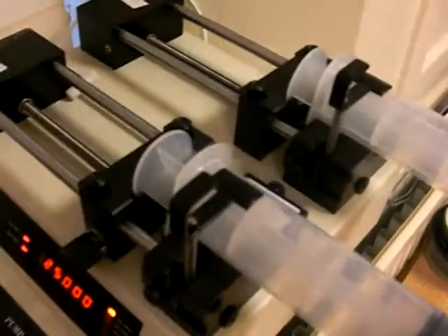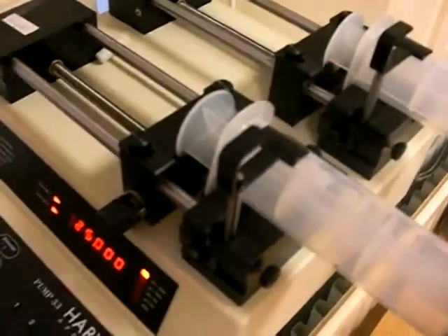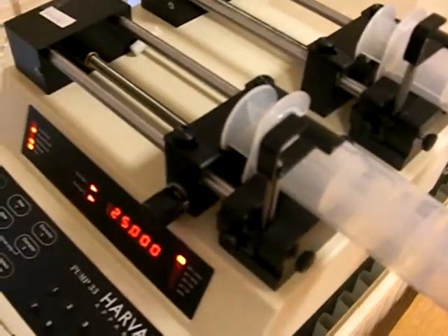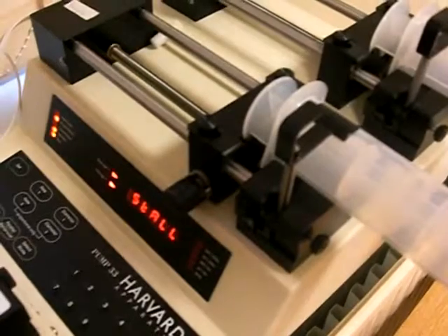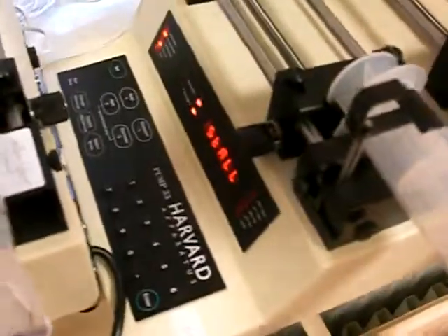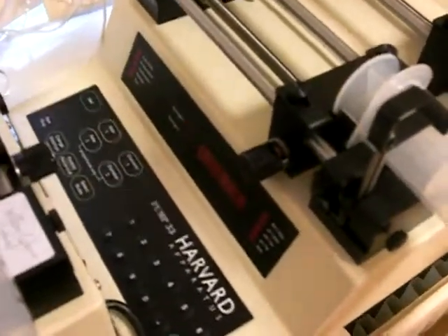Let's see what happens when it reaches the end of the rail. I think it should give us an error message — it might just stop. We have the same error as before: it says 'stall'. To get past that again, we have to switch the pump off, switch it on again, and specify that it's pump 02. And as before, we have to reset the system.